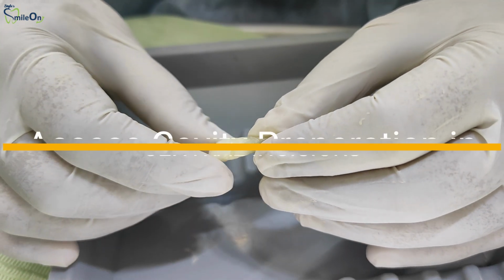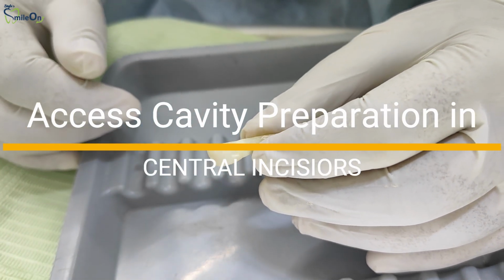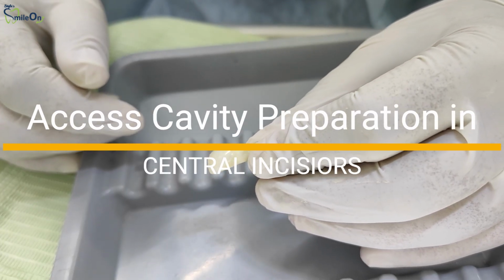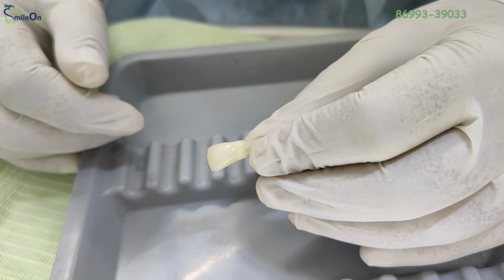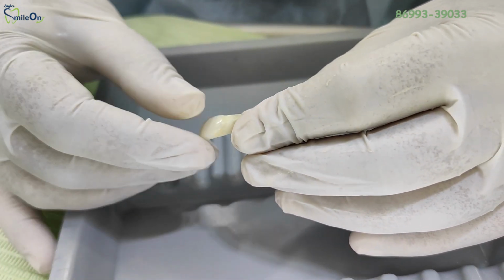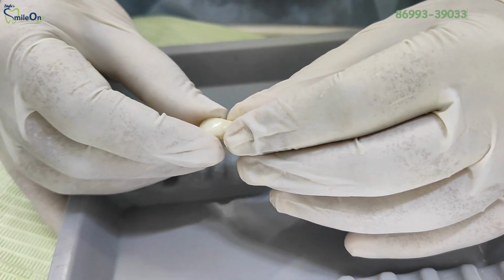Hello, this video is regarding access opening in central incisors. Before starting with the access preparation, first we have to understand the anatomy of the central incisor. As you can see, this is the crown portion, this is the root portion.